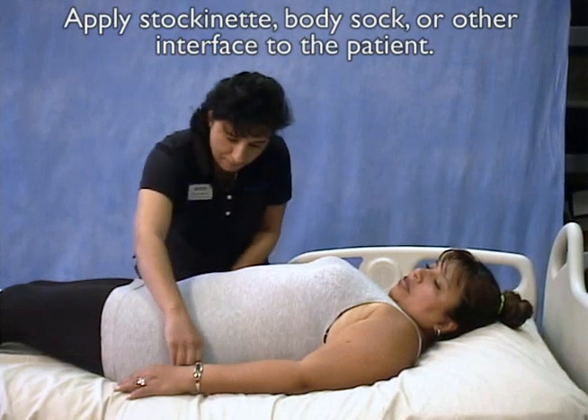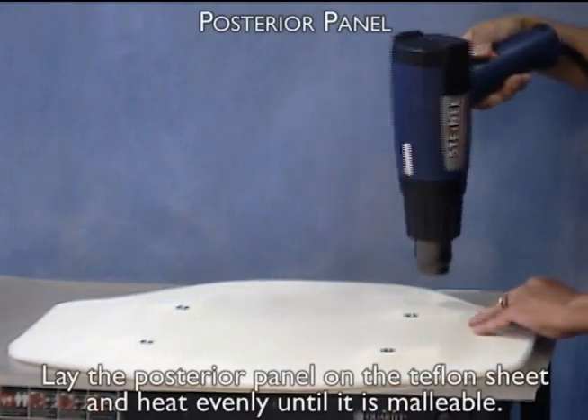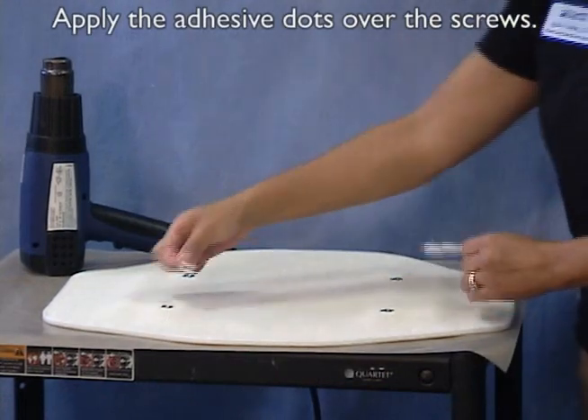Apply stockinette, body sock, or other interface to the patient. Lay the posterior panel on the Teflon sheet and heat evenly until it is malleable. Apply the adhesive dots over the screws.